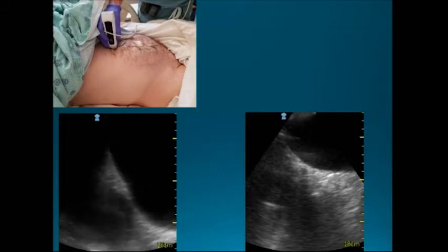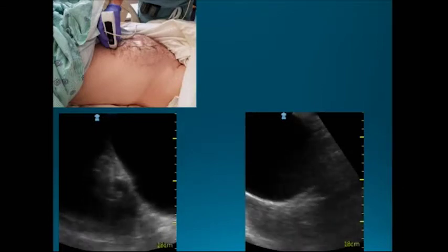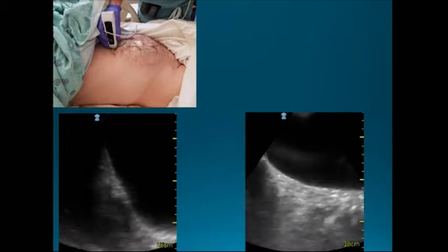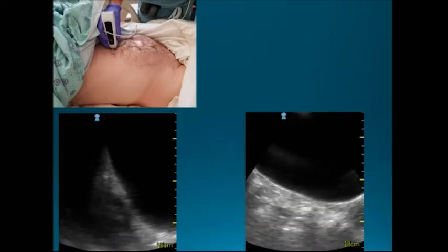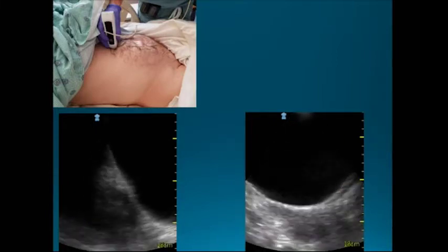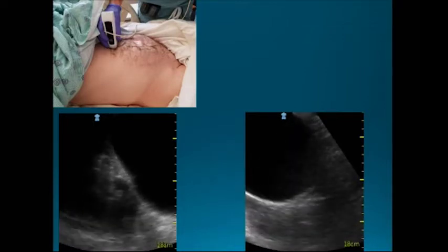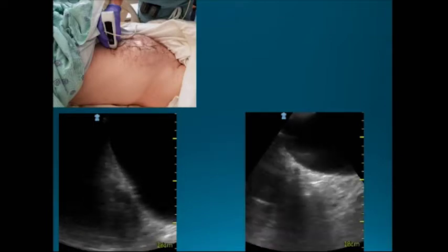In the clinic, in addition to looking at the kidneys, we also look at the bladder. And we see a lot of incontinence evaluations, a lot of dysuria type of complaints and things like that. In this case, this is a patient's belly. Up here there's his umbilicus right here. This is the ultrasound probe, and this is us bouncing up and down, you sure you don't feel anything right here? And so black is fluid, again, and so this is a big, well-circumscribed thing of black fluid, and if we take the ultrasound probe and go from here down into the belly, we see all of this. And what do you guys think this guy has? Bladder obstruction, right? His bladder is coming all the way up to above his belly button.